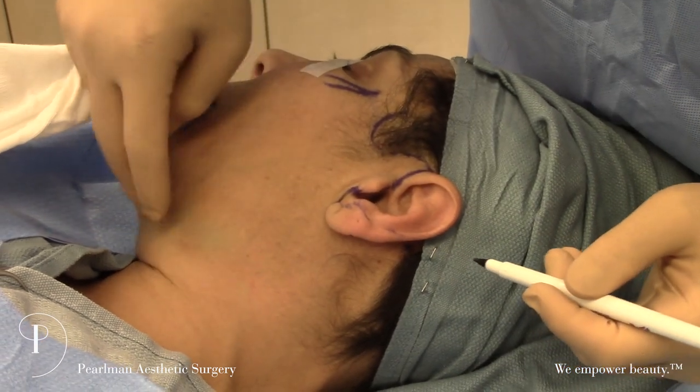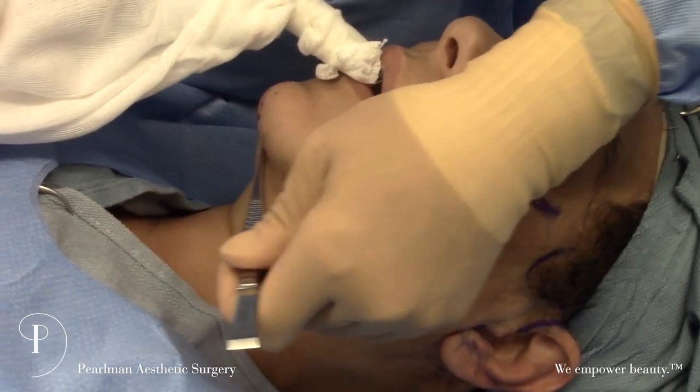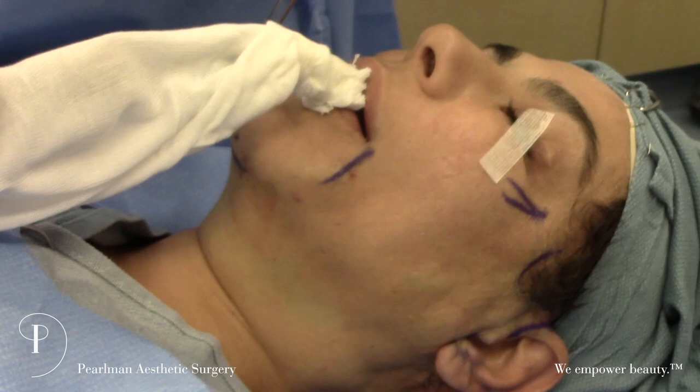We have an incision under the chin here in the chin crease. That's to give us access to elevate the entire neck.